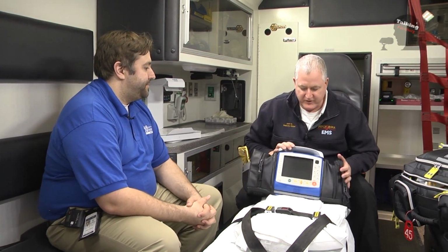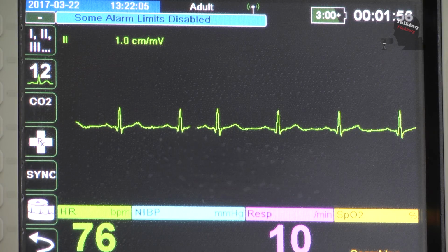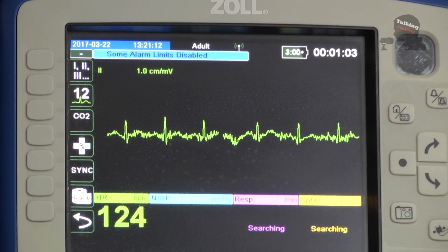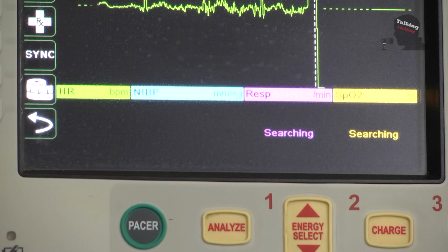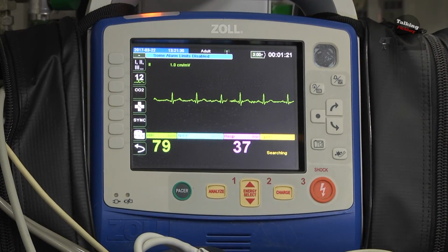So we have the Zoll X-Series monitor, so that's what a lot of the ALS services in Dane County use. It's compact, it's fairly light to carry. The nice thing about this monitor is that we can put a blood pressure cuff on. We can do cardiac monitoring, a 12 lead EKG to look at the heart, a pulse ox, and end-tidal CO2, so we can check somebody's respiratory or cardiac status. And it's all right in this unit. It allows us to defibrillate, obviously, if we need to. And from here we can also send the 12 lead EKG directly to the hospital.